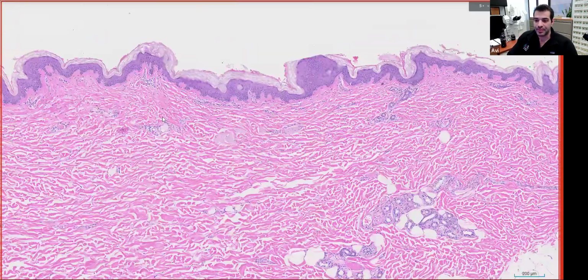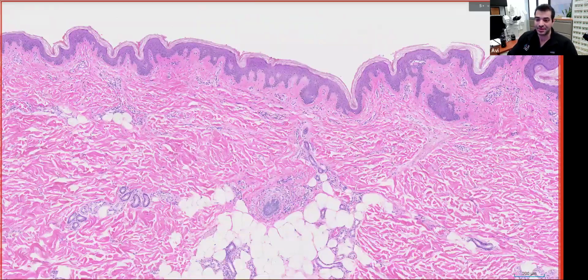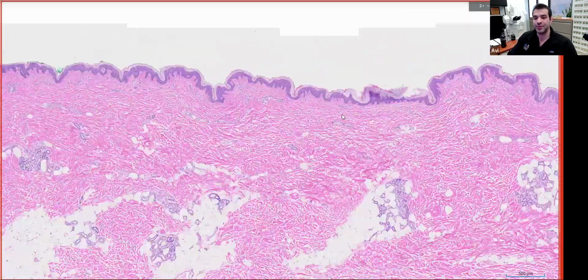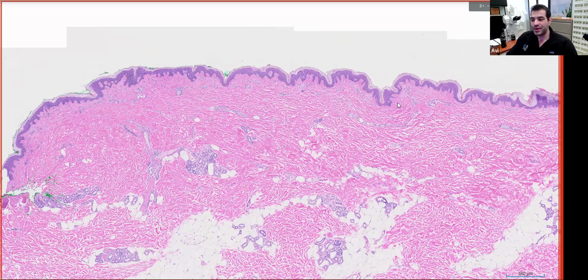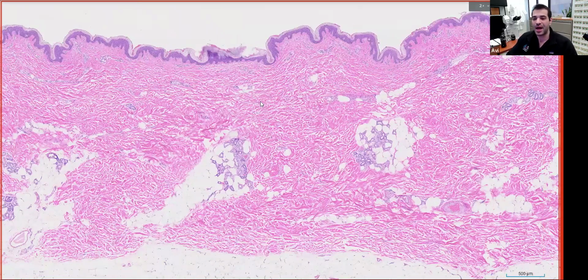And those who are adept at picking things up, it's just a time waster. You could have just moved the slide physically much faster. You want to be able to move it faster on the digital slide. This is not a problem when you are looking at a very complicated case and you have to think about it anyway. Then it doesn't matter what you do or how you pan because you're going to take an amount of time on the slide anyway. You're going to be thinking.